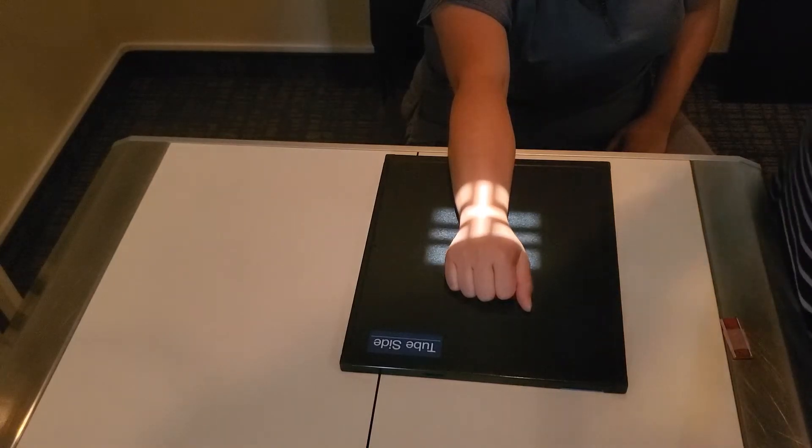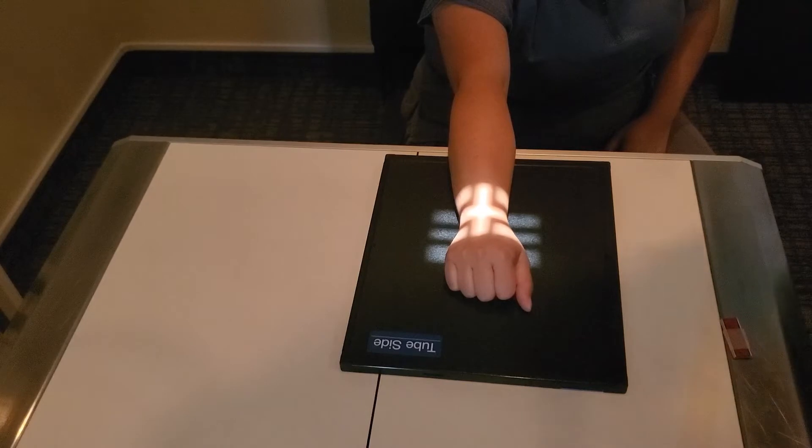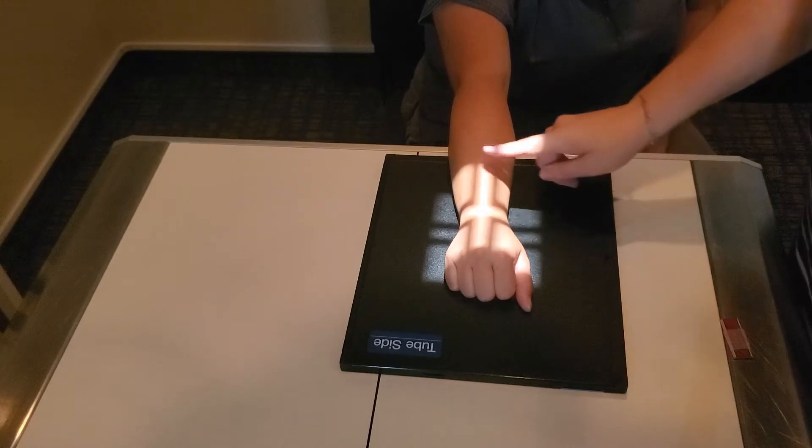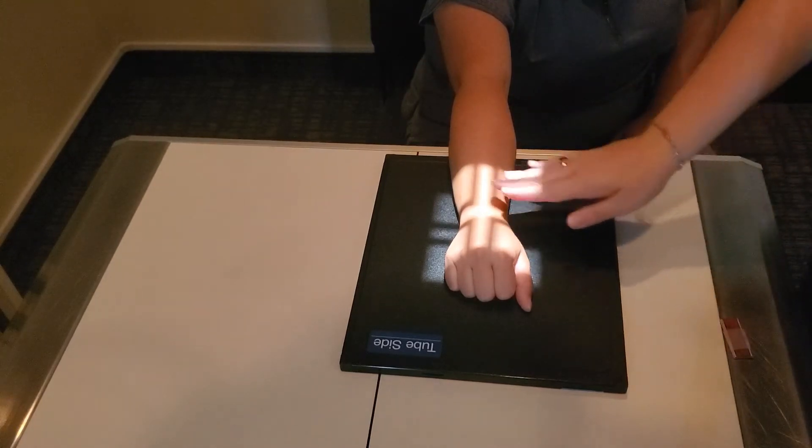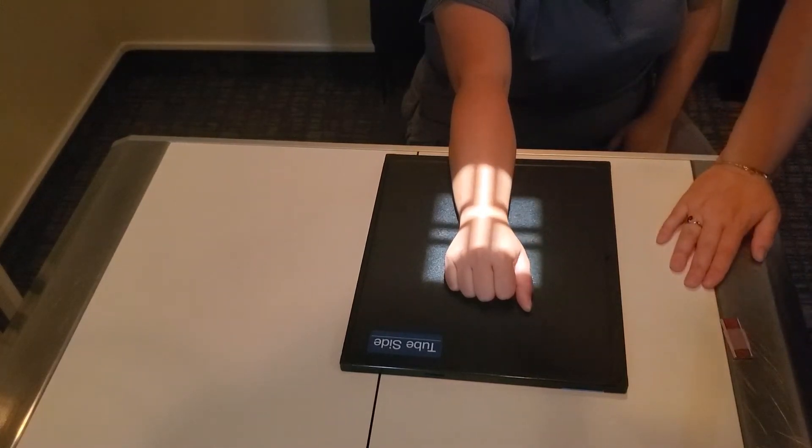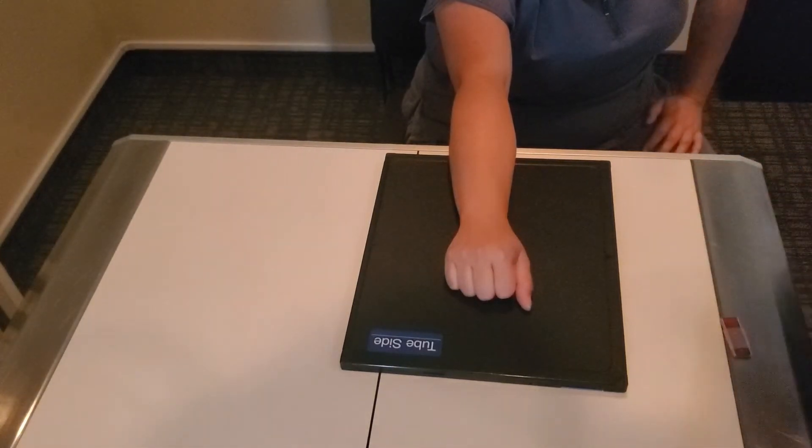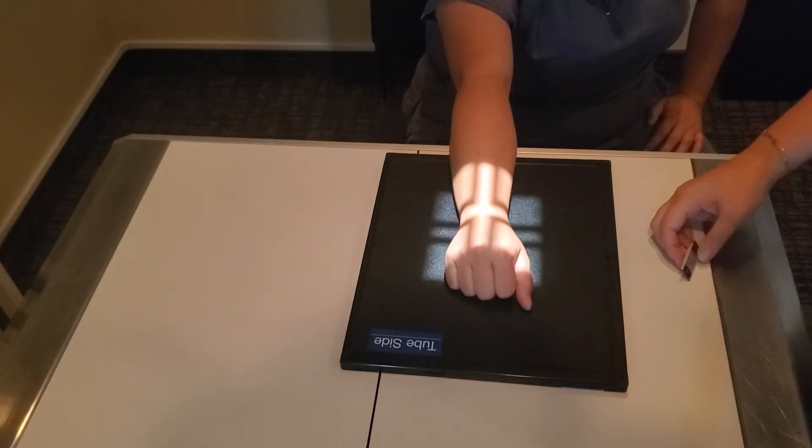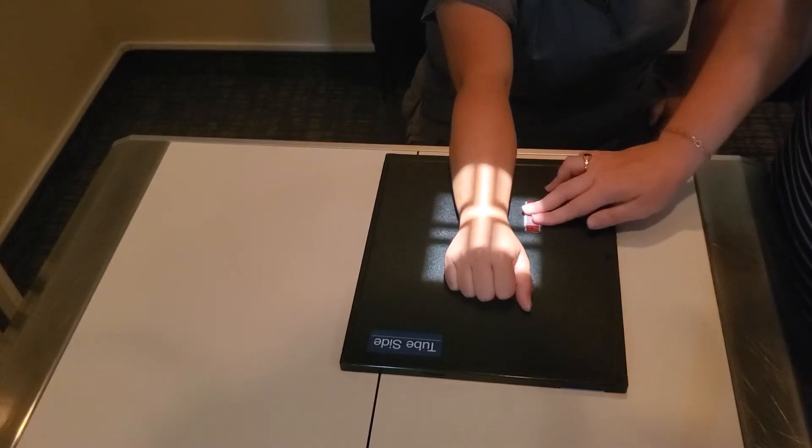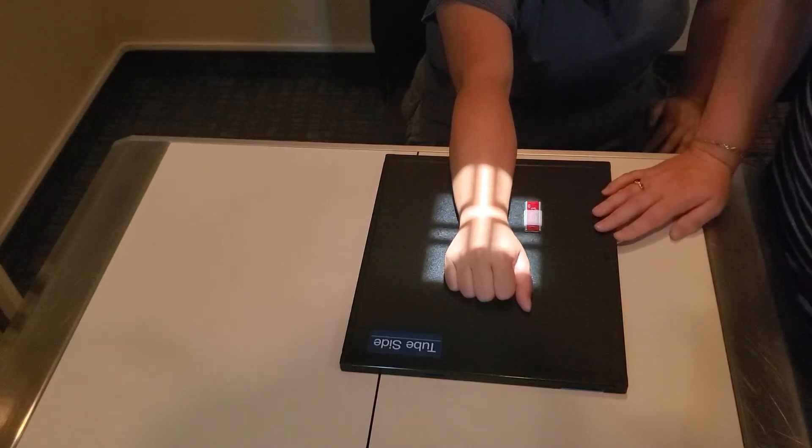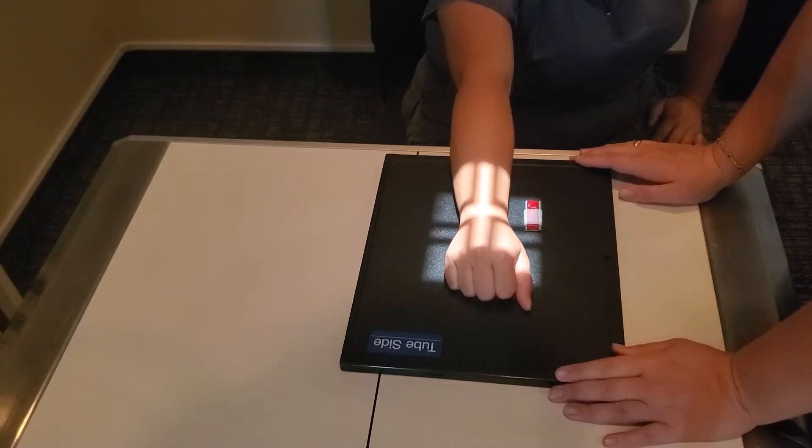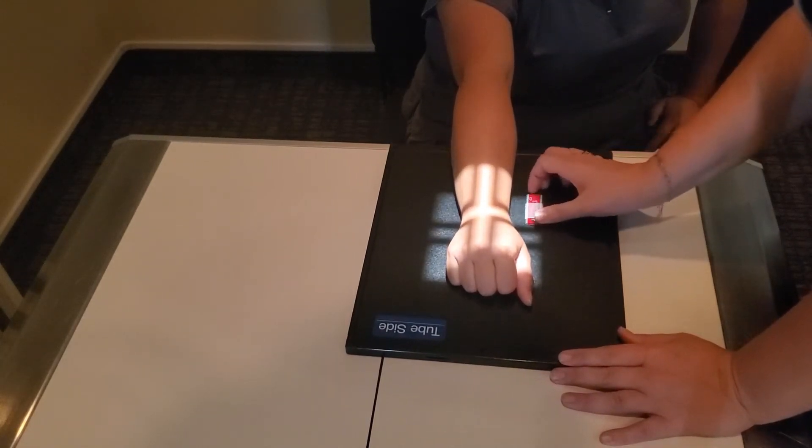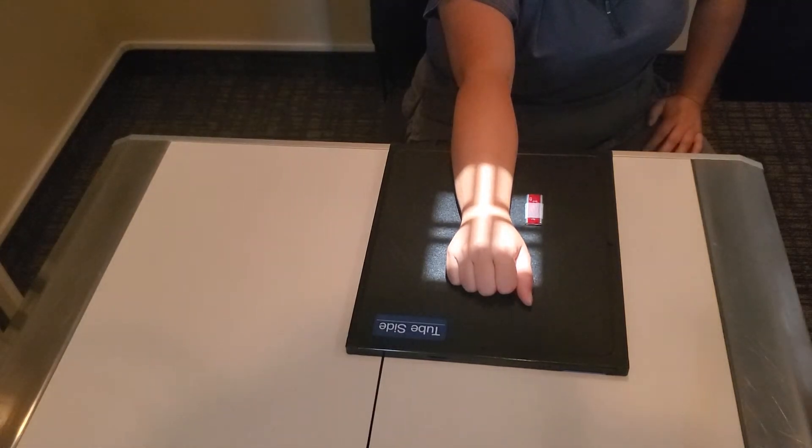I think Merrill says a half of the metacarpal but that's much too small. Again radiating pain is real so you want to make sure that you have enough room where if there was an injury somewhere on that forearm it could cause the wrist pain and not actually be a carpal that's injured. So I'm going to put my marker down and again I'm in that mid-carpal area. And that is your PA wrist.